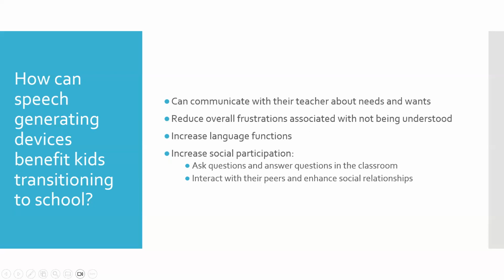So how can speech-generating devices benefit kids transitioning to school? There are many benefits to clients having a speech-generating device in the school setting. They can communicate with their teacher about their wants and needs, and this will reduce overall frustrations associated with not being understood. Speech-generating devices can increase language functions.